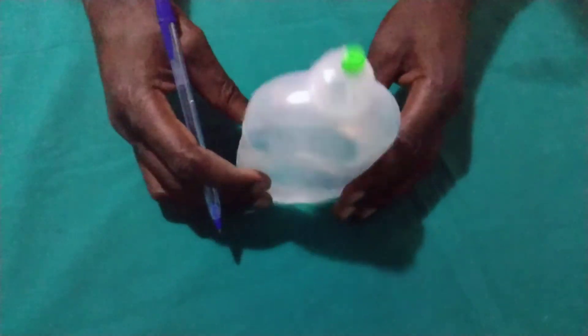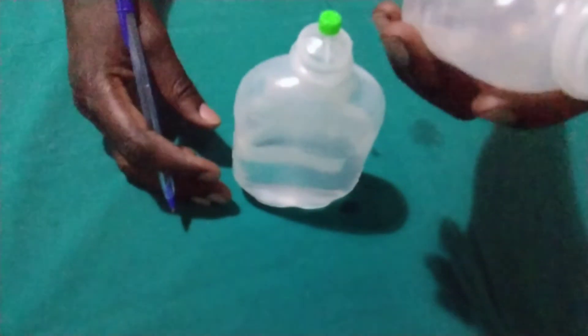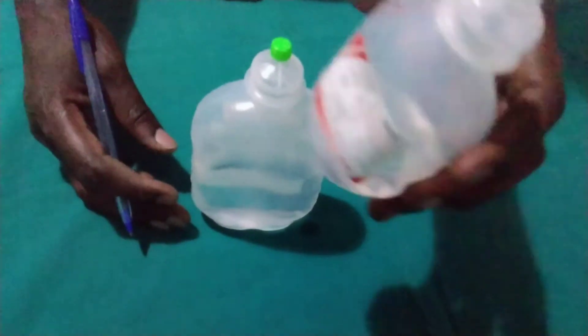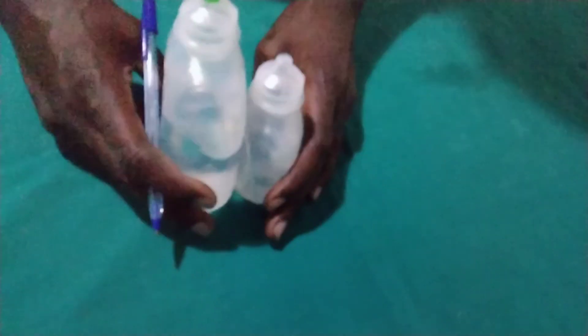Then you are going to aspirate 100ml, then you will replace with 100ml of dextrose 50%. So that is all.